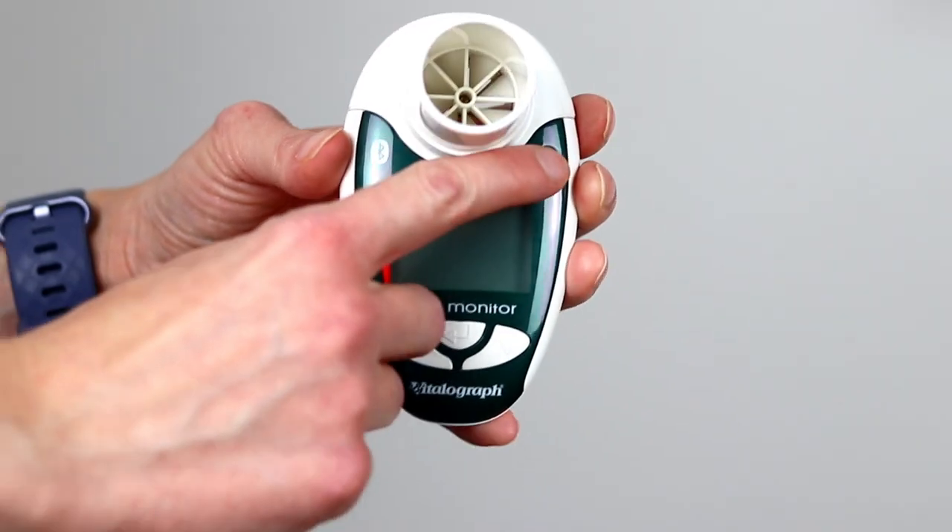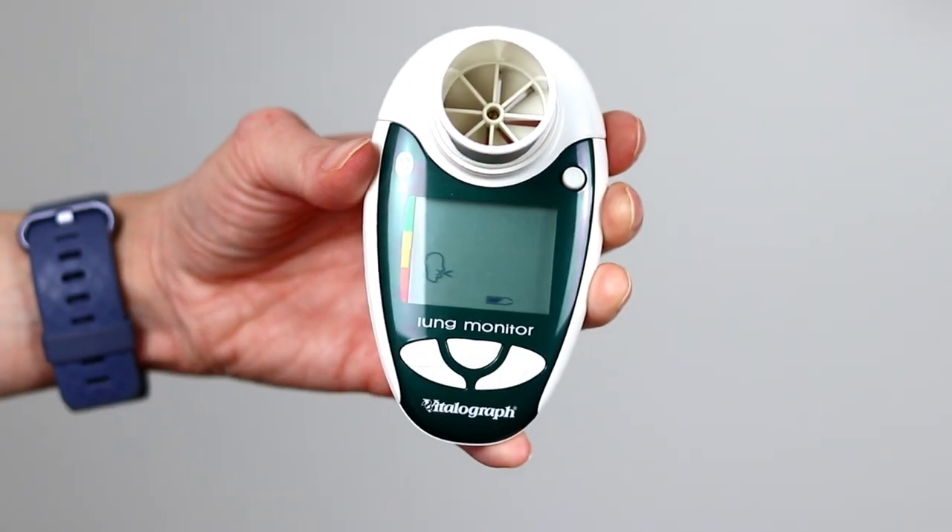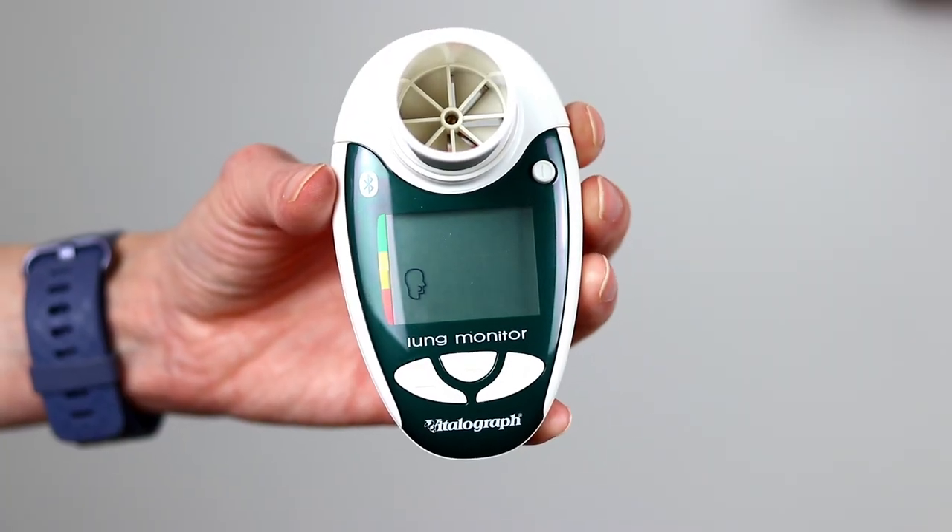Once you have inserted the batteries, press and hold down the small circular button at the top right hand corner of your device to turn it on. You will then hear two beeps to confirm that the spirometer has turned on, and you will also see an on-screen icon of a head blowing air.